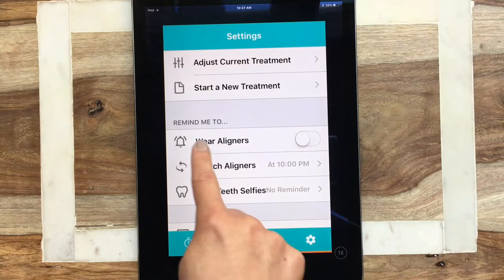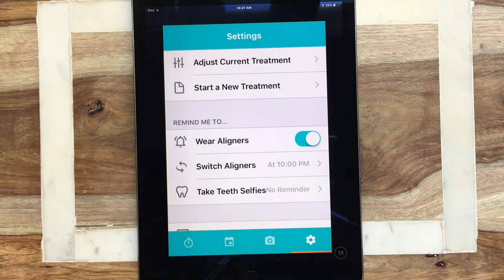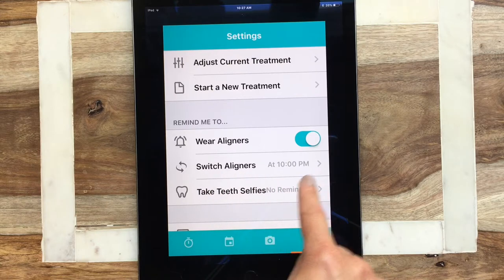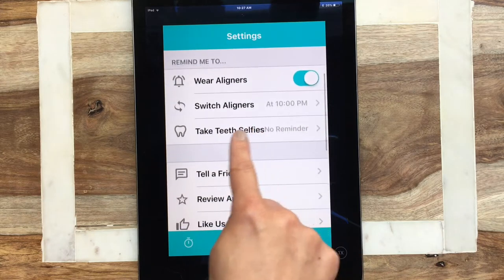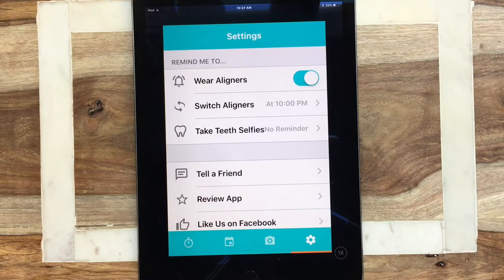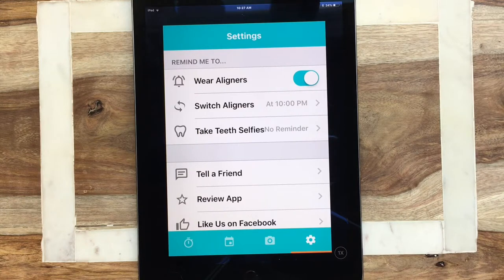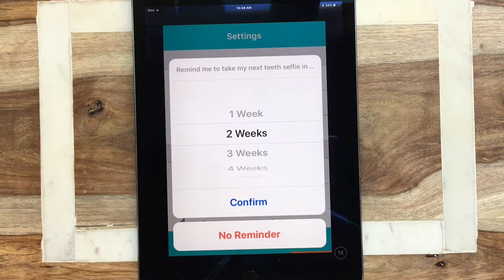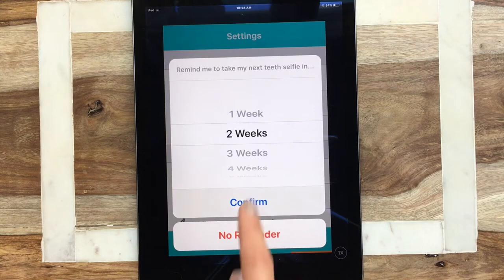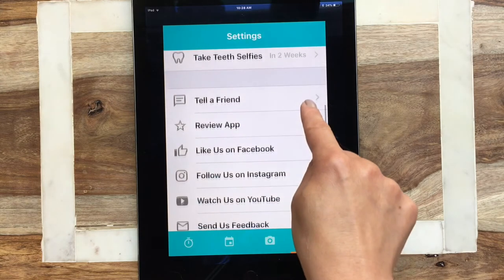For 'remind me to wear aligners,' you definitely want to turn that on. The switch aligners reminder is set at 10 p.m. It's also helpful to take teeth selfies — as you're going through the process, which can be long and tedious, we sometimes forget the changes we've made. It's nice to look back at tray 1, tray 5, tray 10 and actually see the progress you've made, which will help motivate you. I'll remind myself to take a selfie every two weeks — hit confirm.